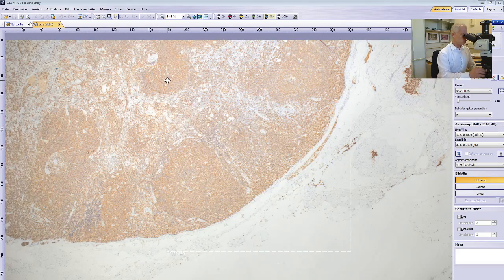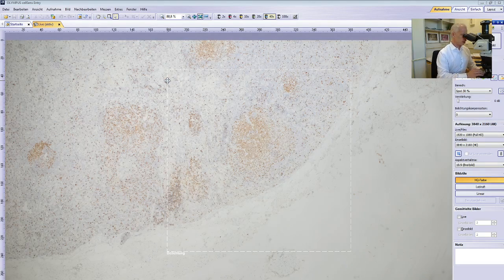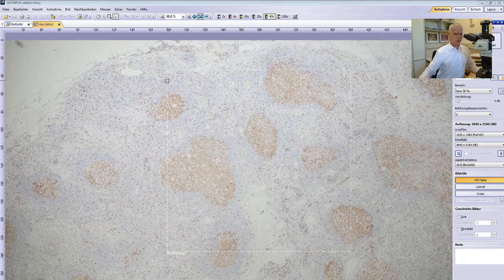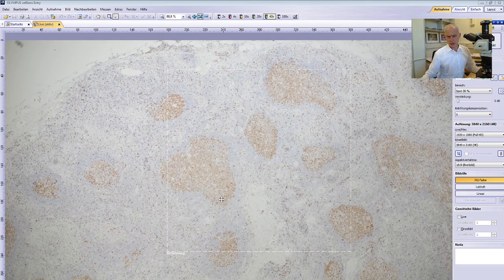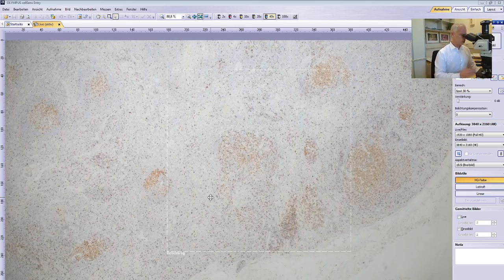The other thing I'm going to do is always to stain for Ki67. That helps me to identify these germinal centers. And you see here that some of these germinal centers in Ki67, as expected, are highly proliferative. And the outer borders are relatively well defined, whereas others, actually fitting what we have seen morphologically here, have a little bit reduced proliferation and a little bit less well-defined outer borders.